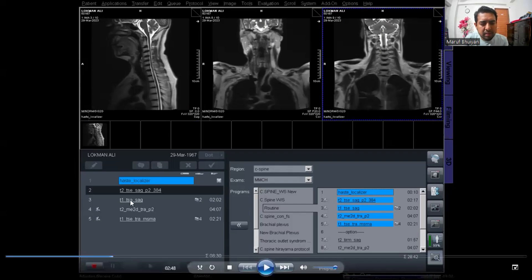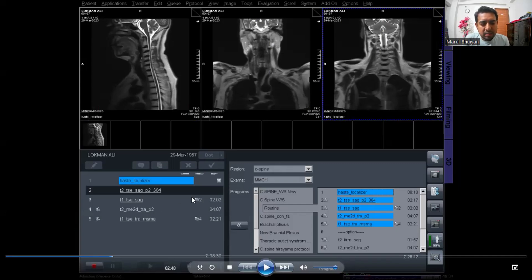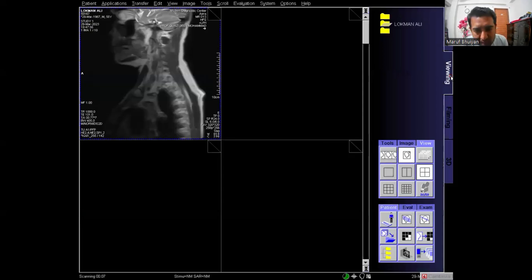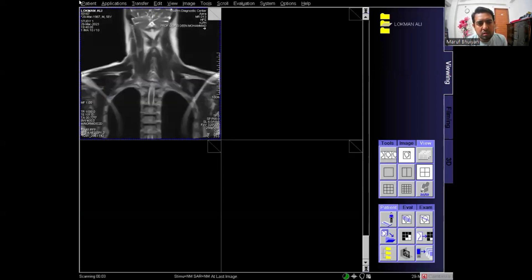Look at the T1 sagittal. Beside it there is a sign that says 'Copy 2,' which means when you plan protocol number 2, this protocol will copy the planning of number 2. So as I plan the T2 sagittal and click apply, the T1 sagittal copies the plan from the T2 sagittal. You can also see another sign 'Copy 4,' meaning that protocol will copy number 4. I am now waiting for the T2 sagittal image, because I need to plan the axial protocols on it.